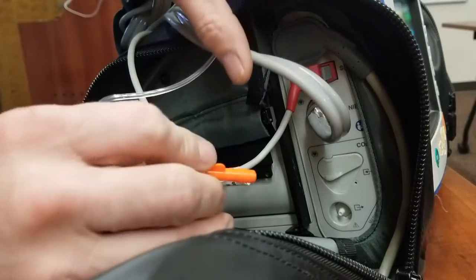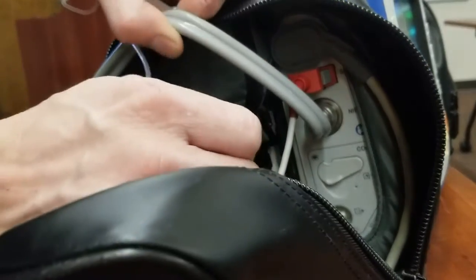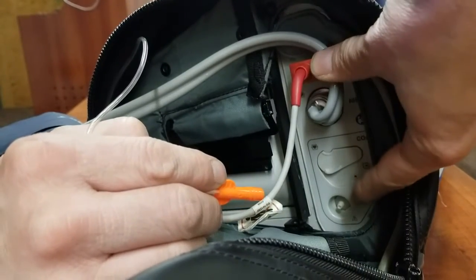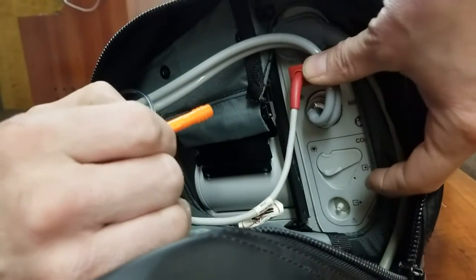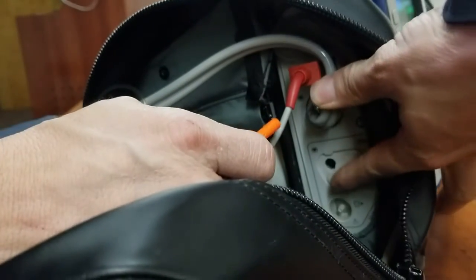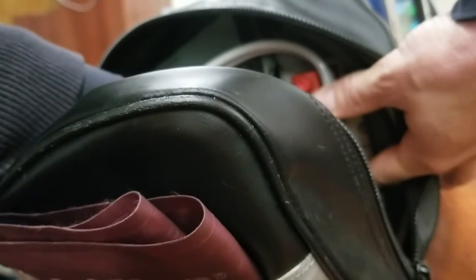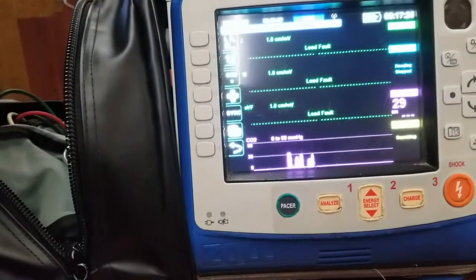Here's a close-up view of how we apply the ETCO2 to the monitor. This is in the blood pressure cuff pocket of the monitor. We have this little trap door on this side, and then the port at the bottom. The port at the bottom is kind of deceptive. That is not what we plug it into. That's actually the exhaust system for the ETCO2 monitoring. We just open this trap door by pulling it down, and then we insert our half-turn luer lock into there firmly, twist about a half turn. Seems closer to a quarter turn. And once we have that in place, the pump will start up again automatically.